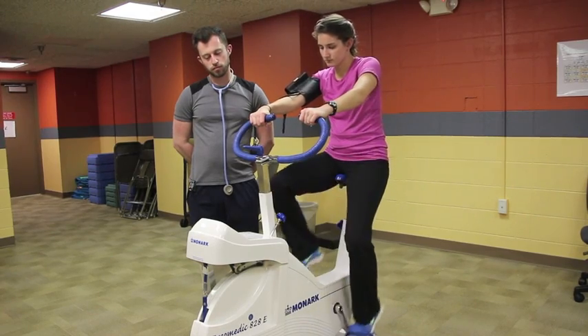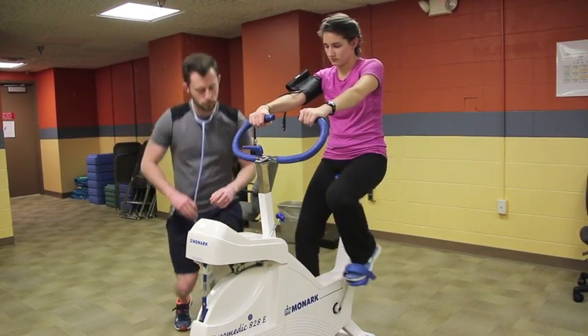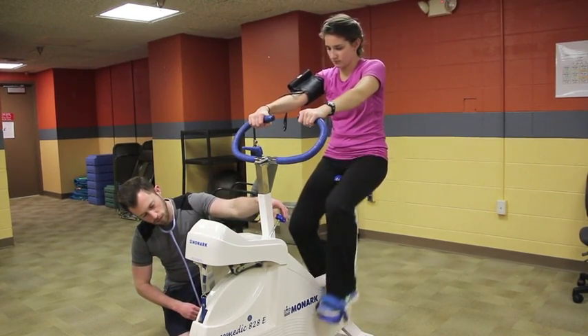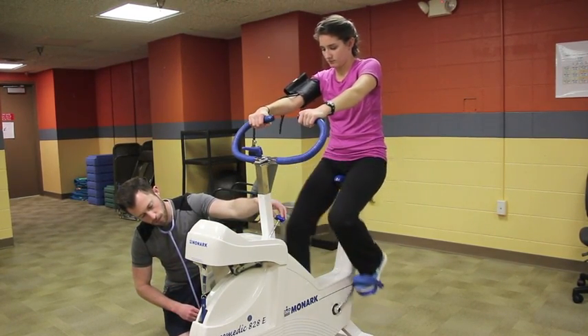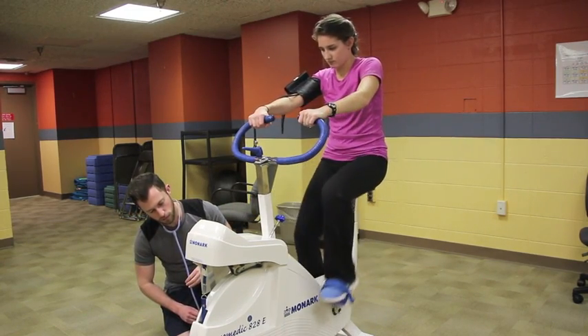For stage 1, you will determine the workload based off of the heart rate recorded at the end of the warm-up stage. Refer to ACSM guidelines in order to determine the workload.